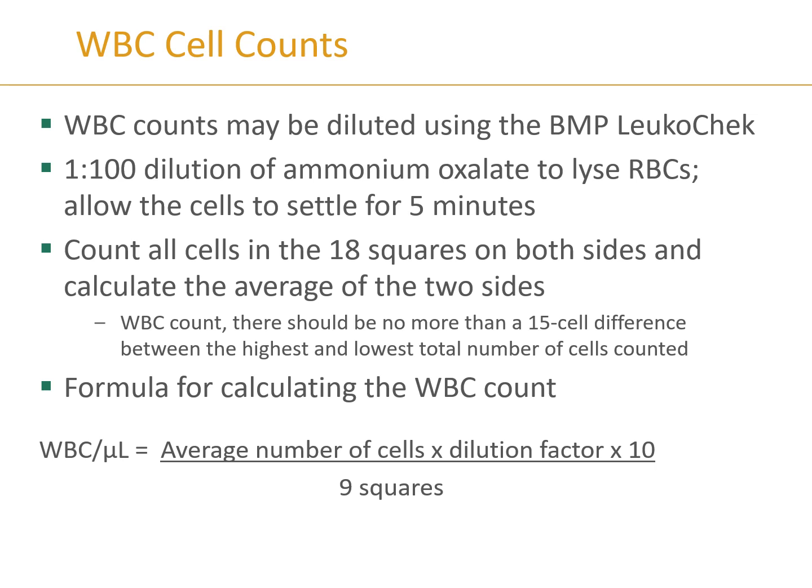Now, of course, the site that you work at could have some different criteria as far as what they use to dilute out these specimens, but there are commercial type kits available, as well as just some other reagents that can be used to help with dilution of those white cells if you have high white counts. Or if the specimen contains a lot of red cells, then you may need to lyse those red cells with some sort of reagent in order to do that count.